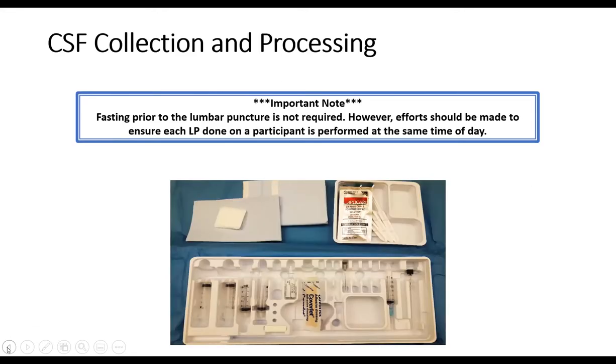Well, I guess I should say, this is what the LP tray will look like that you'll get. We don't require fasting for the LP. However, we do ask that you try to have the LP done on the participant at the same time of day each time they have an LP. So if you did it first thing in the morning, like an 8 a.m. or 9 a.m. visit, for that screening visit, when you do their week 24 or early termination visit, please try to do it at the same time again for that visit.